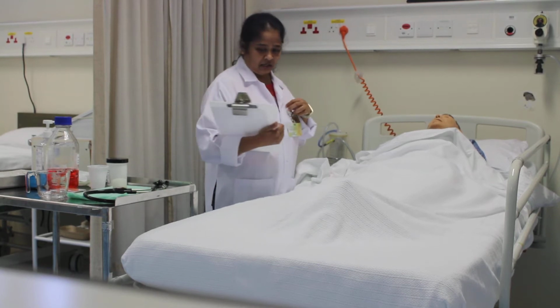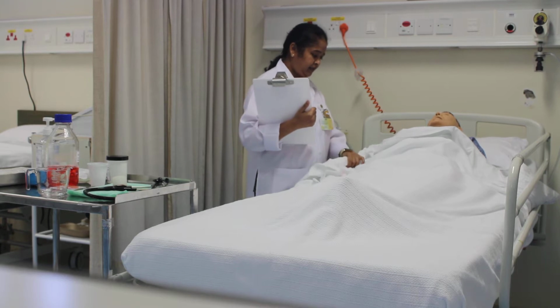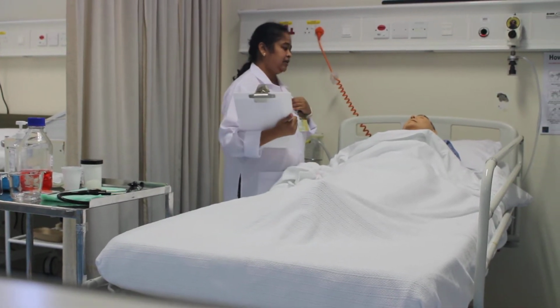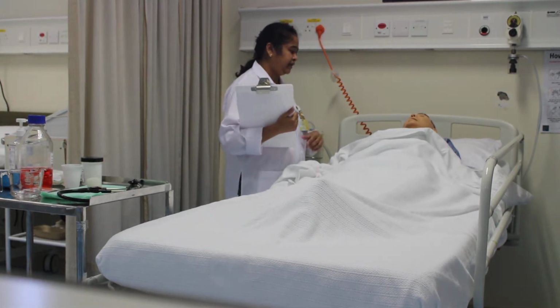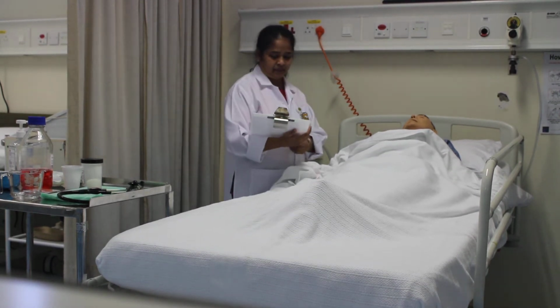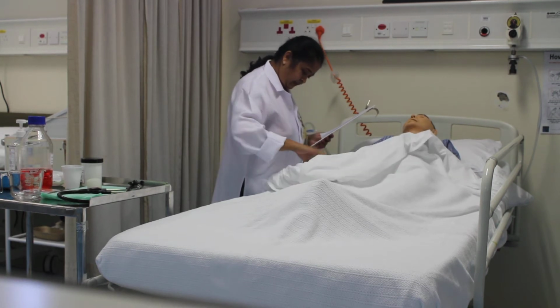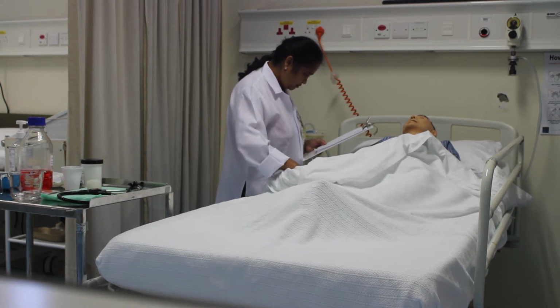Okay, so good morning sir, how are you? And I am your nurse today. My name is Jansi. I want to do some procedures on you. Before that, can you please tell me your full name? Muhammad Ali. Okay, can I check your ID badge please? Yes. Muhammad Ali 01285.